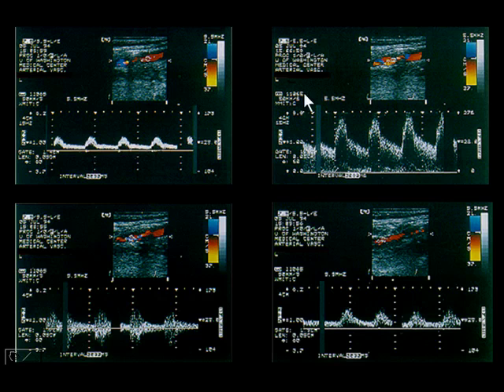We would then move on through that stenosis, eliciting the highest velocity within that lesion. And the way that's done is by moving that sample volume back and forth throughout the color flow image, up and down within the vessel, to find the highest velocity within that lesion, keeping in mind that this is the velocity that should be reported to your interpreting physician. The highest velocity is the one that will be used in the estimation of the stenosis range.